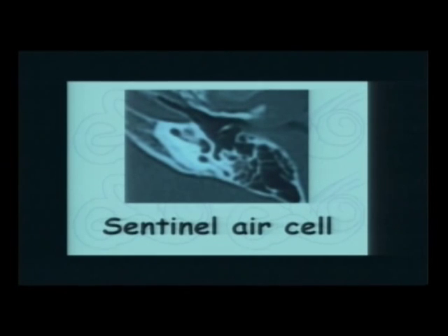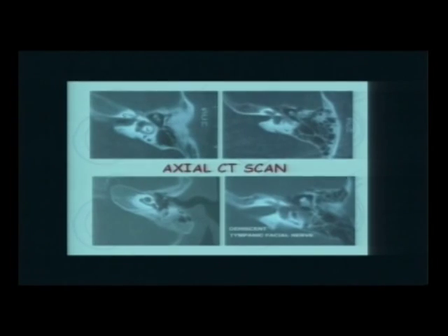Be very careful. If you have a large sentinel air cell, sometimes it's going to expose the facial nerve. And when you just open this cell, you find that the facial nerve is exposed inside this cell. So always very good irrigation, and always see where you're drilling. You've opened this cell, look into this cell first before continuing your drilling. So be very careful with sentinel air cells.